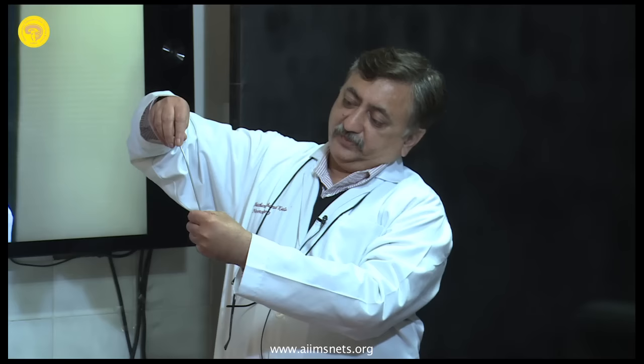And remember, the S1 pedicle is very forgiving. It is very big, very wide. So you can't go wrong in the S1 pedicle. If you go wrong in the S1 pedicle, that means your imagination of the anatomy is grossly not correct. The medial angulation has to be much more in the S1 pedicle because of this shape. You see, the S1 is sloping like this. So you have to try and hit the bone here so that you get the maximum length of the screw inside.